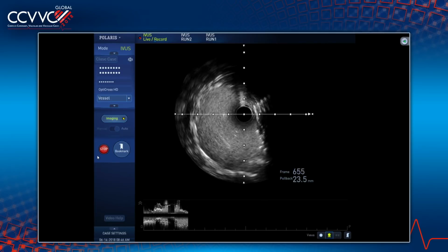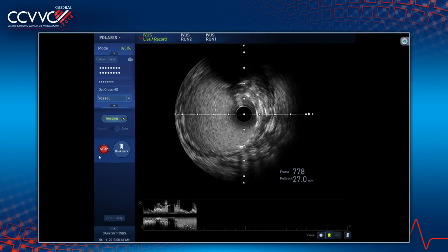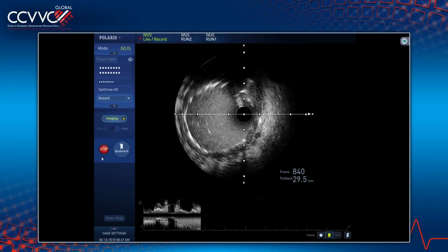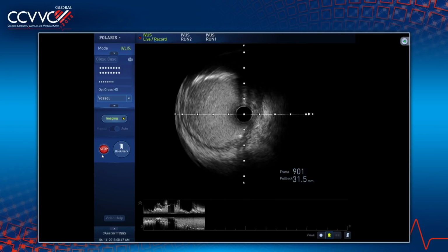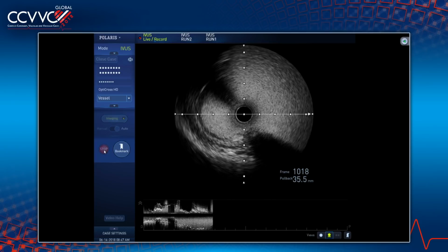What a beautiful result. It looks good, but I didn't know if the distal edge was actually well apposed, I've got to say. We'll see it again. I quickly glimpsed that, but I didn't see it fully. Definitely the proximal is very well apposed. Okay, show it from the beginning.